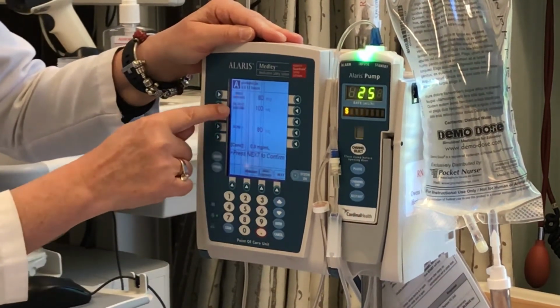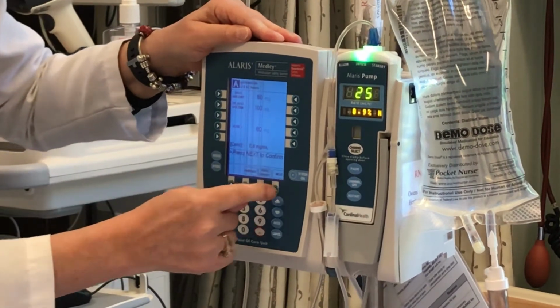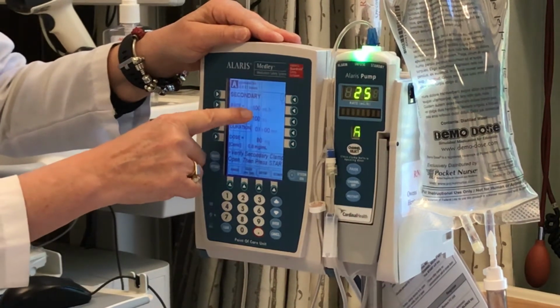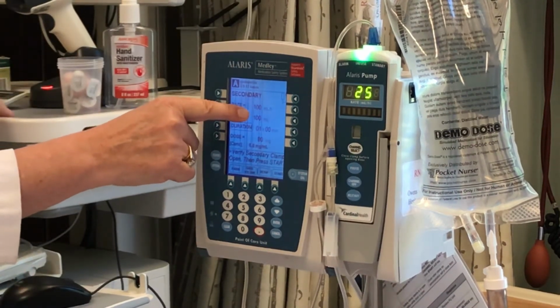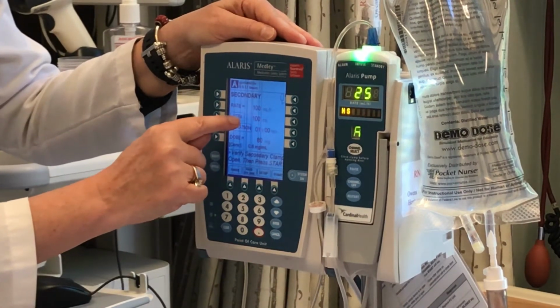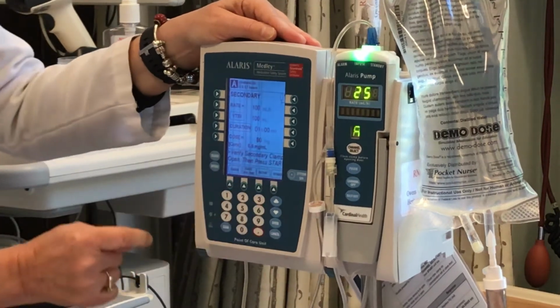The dose is 80 milligrams. The amount is 100 ml, and the dose is 80 milligrams. I hit next as a confirm. Again, it goes through another screen. Now the first thing it has at the top here is the rate is 100 ml per hour. And that is correct because I calculated in my previous step, and now I know that the pump has calculated it correctly. It's 100 ml per volume to be infused, and the duration is 1 hour. Everything is correct, and now I can hit start.